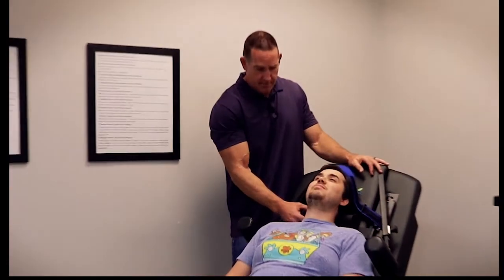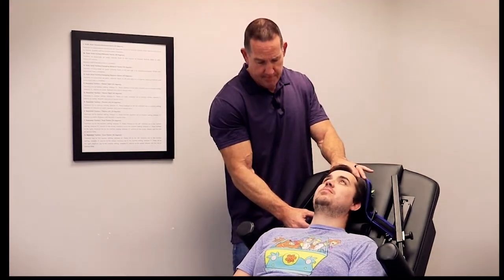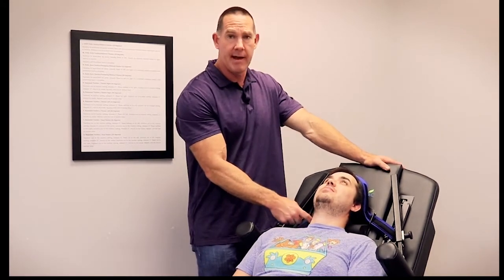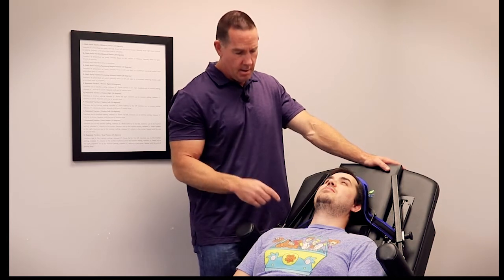Seth, is that very comfortable? We don't even have a pull on it and it's just uncomfortable — that's hooked under the occiput. But if we drop this down, you see how the head settles back and actually sits right on the back. The other thing is make sure you don't have too much on your pillow stack. I start pretty much everybody out with just a single pillow.